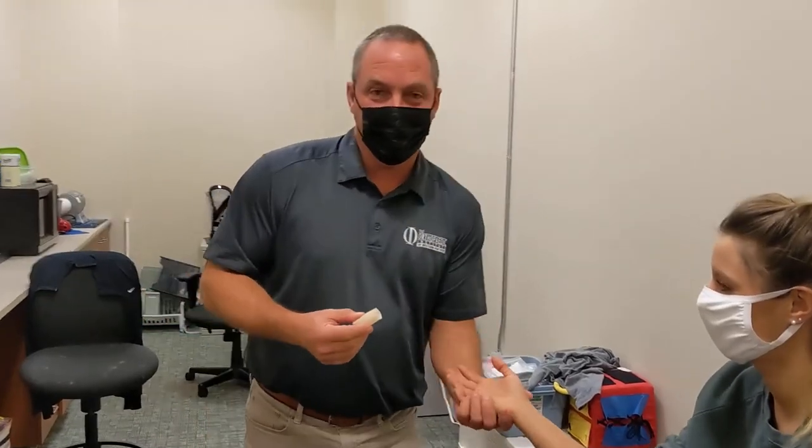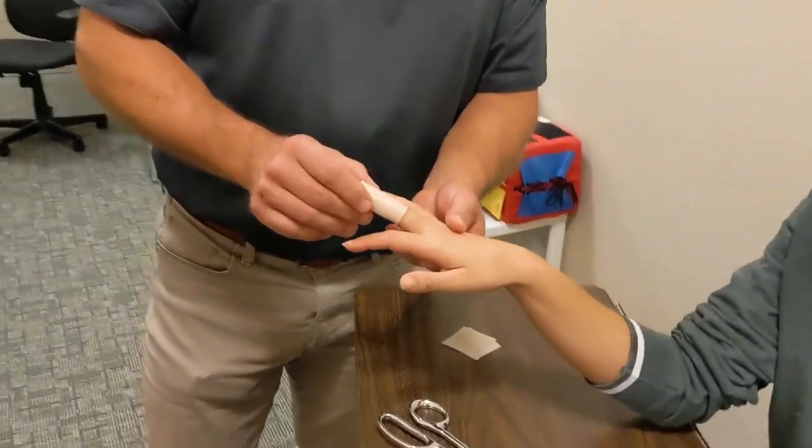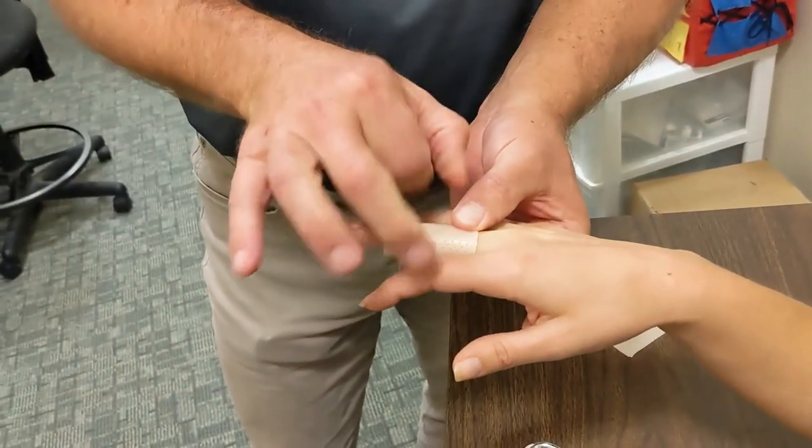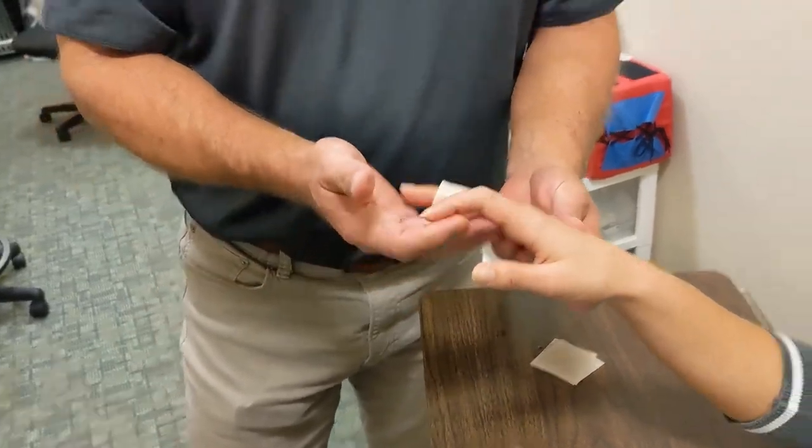So now the splint is completed. It easily slides on and off and it's rigid. It provides quite a bit of protection for an injury to your finger. And that's our finger cylinder splint.